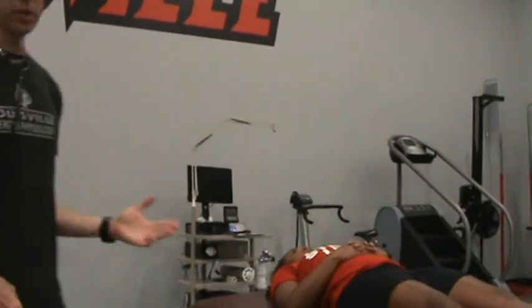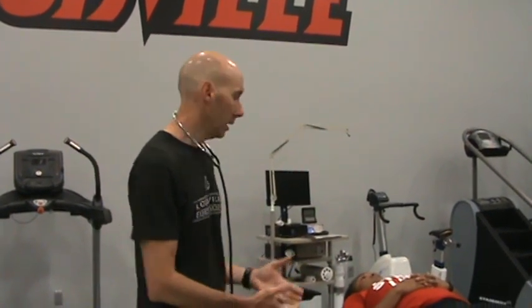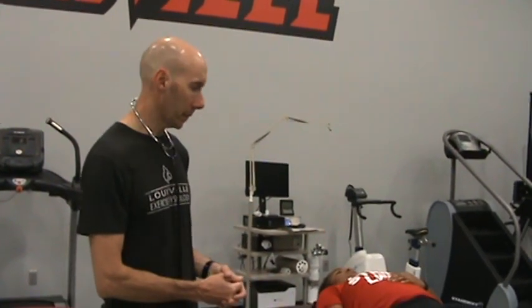So a key thing with blood pressure is we always want to make sure the subject's arm is supported either by the device they're lying or sitting on or by you. I'll show you the different ways we can do that. Since Lindsay is lying on an exam table and there is plenty of space, I can just have her extend her right arm out and rest it on the table. We want to make sure the arm is supported at heart level. Since she is lying supine, that's a perfect thing to do.